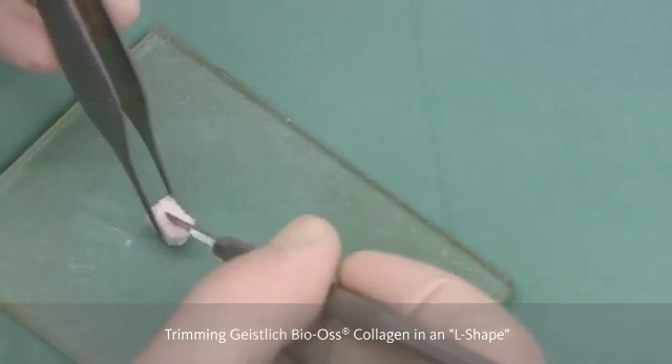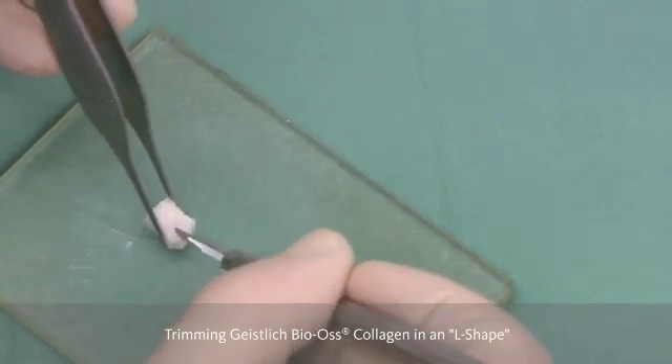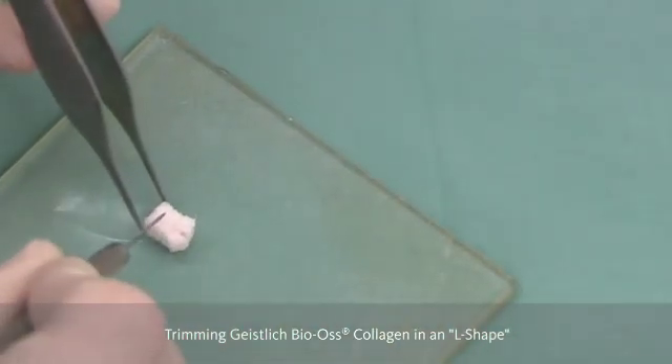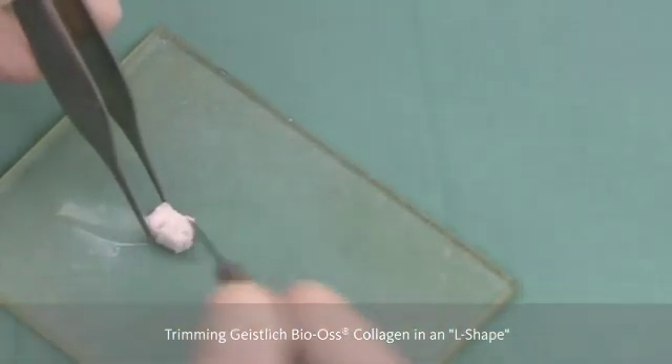We do this when the Bio-Oss collagen is wet, as it is going to be a little bit easier to cut, and we cut it into the correct dimensions using a blade.